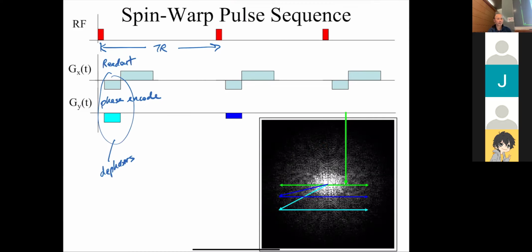The RF, the first signal, makes the spin tilt, so it flips the spin. Okay, so imagine I tip the spins, and remember the signal decays away. Then I need to wait for the signal to recover, and then I tip it again and I get a shot at it.